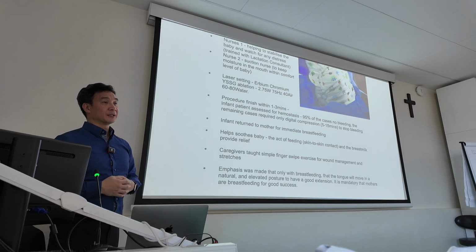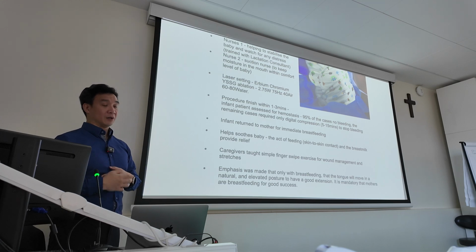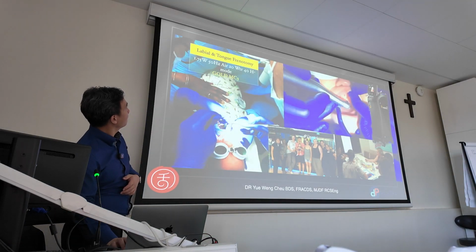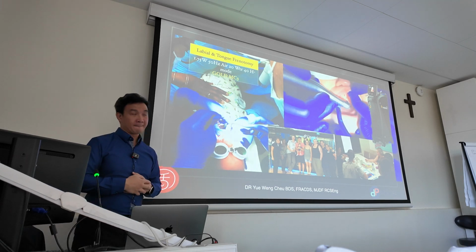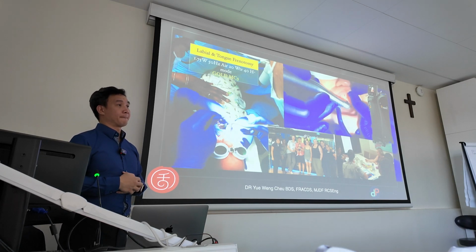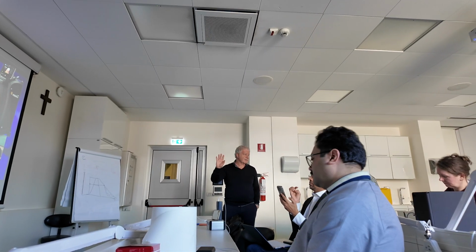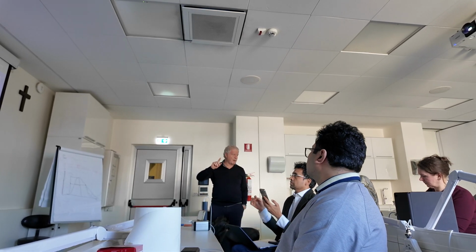The other one before, when you started, the first you did, was 50 Hertz. Which one? The first that you did with the picture with all the group. Oh, this one. Yes, was 175. 175 divided by 50. That is the same. So he used the same energy, because at the end it is a laser that is the master. The first time using 50 Hertz, so 50 Hertz at 1.75 watt.